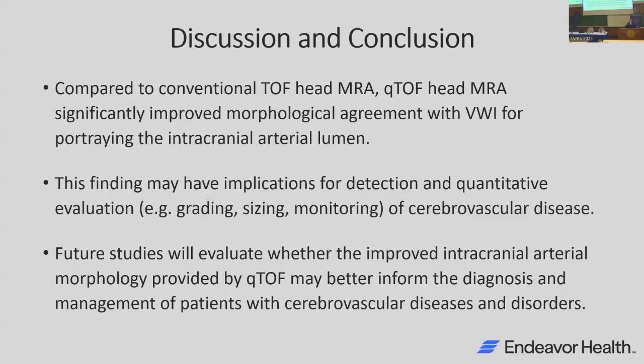Yeah, very nice results. You use the vessel wall imaging as a reference standard, but it may also have flow artifacts because you don't use MSDE or DANTE. Have you considered using something like contrast enhanced MRA or CTA or DSA as a reference?